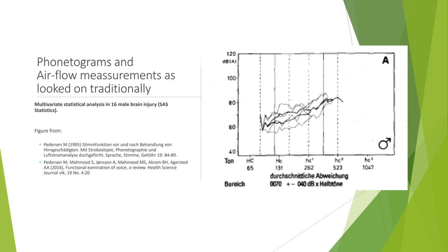As presented in our own studies, there is a rather big variation between subjects. It is well known that intra-subject variability is also very high. So that is one of the problems that might be solved in the future, where the possibilities to make these measurements is much bigger with artificial intelligence. The measurement is of extreme value to document pharmacological treatments if they're exact enough.